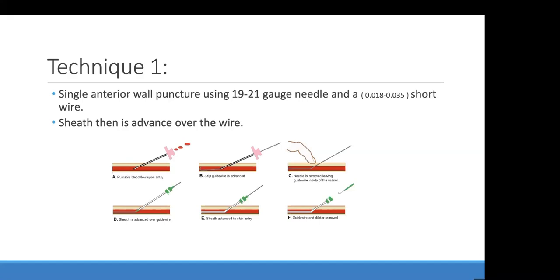Most of the labs here in Saudi Arabia, I noticed they do it with the patient's hands to the side. Where I was trained in Canada, they put the patient lying flat with the hands on both sides, then we move it after the puncture. I found it more convenient for the operator and for the patient. However, get used to whatever your orientation is. Elevate the level of the bed to the level of your back. Don't bend, because if it's a long procedure, getting tired at the beginning of it is not good for the patient or good for yourself.